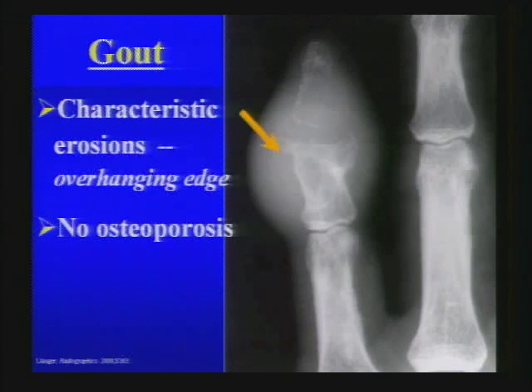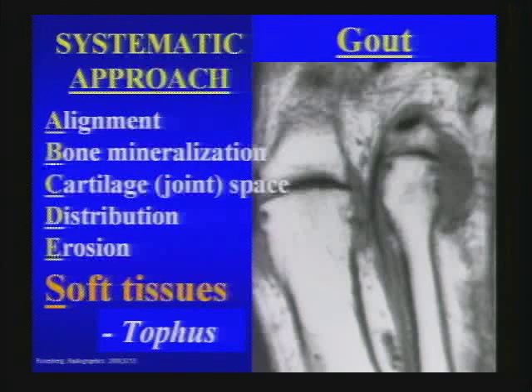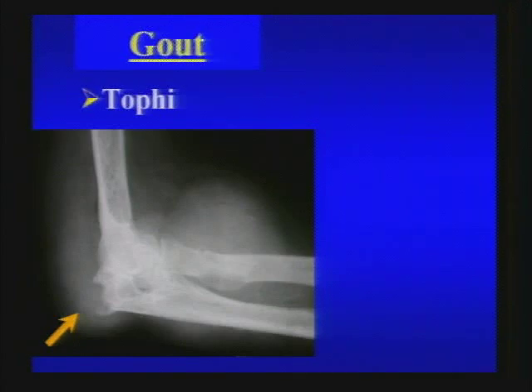Given the degree of articular involvement and soft tissue mass, there is relatively little osteoporosis in the adjacent bones. On MRI, look for eccentric or lobulated soft tissue prominence from gouty tophi associated with small eccentric erosions. These tophi can be quite prominent and cause erosions at other sites — here at the olecranon, here another one around the elbow.